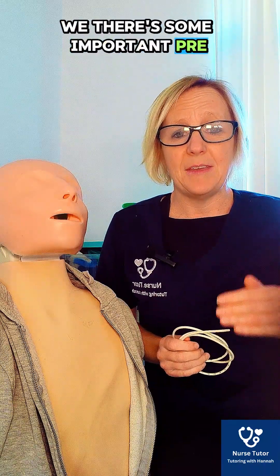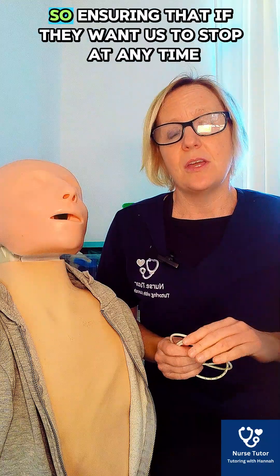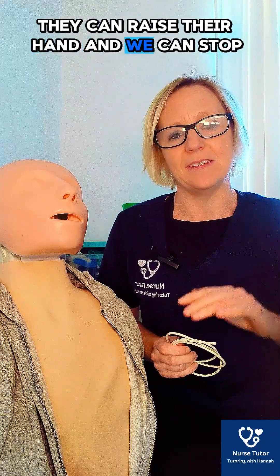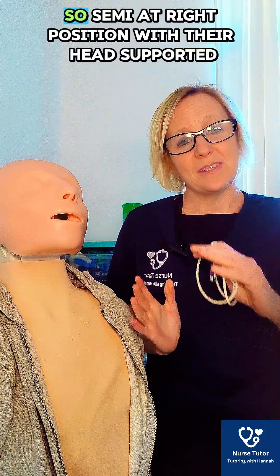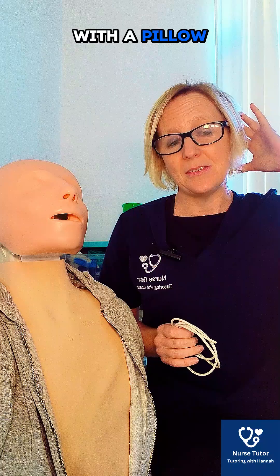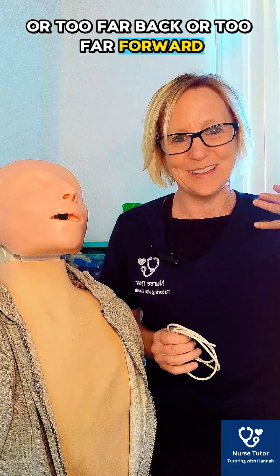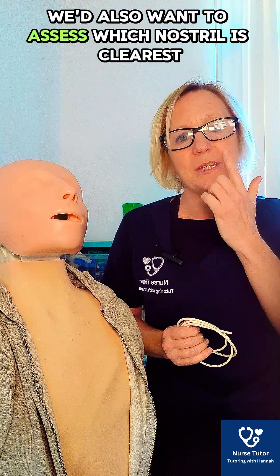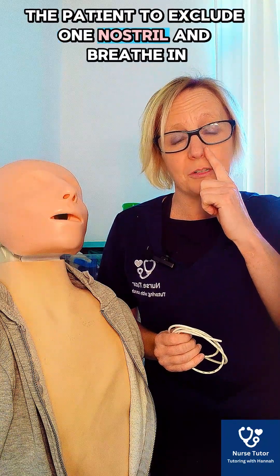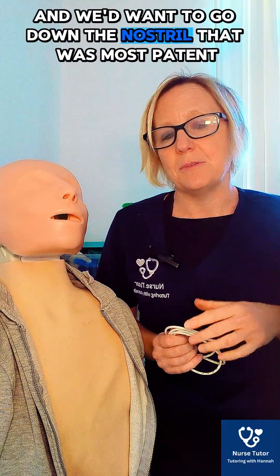There's some important pre-information we need to give the patient. One is arranging a hand signal, so ensuring that if they want us to stop at any time, they can raise their hand and we will stop. We also need to get them in the right position — a semi-upright position with their head supported with a pillow, so it doesn't flex too far forward or too far back. We'd also want to assess which nostril is clearest by getting the patient to occlude one nostril and breathe in, and we'd go down the most patent nostril.